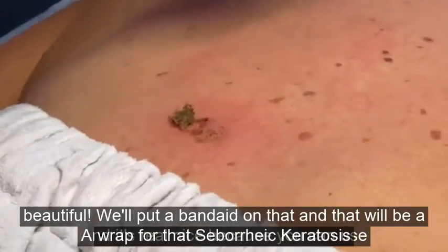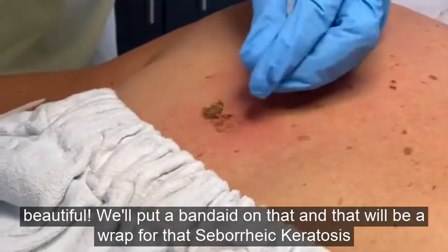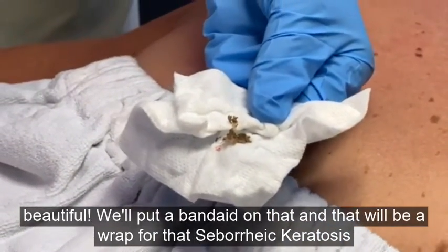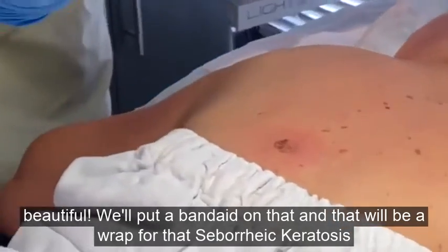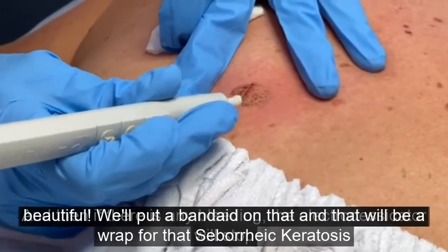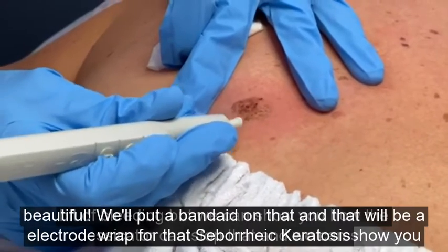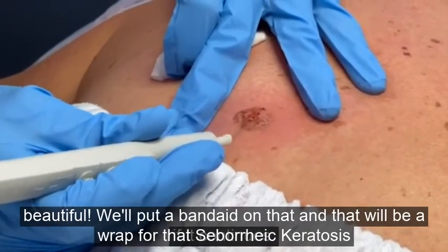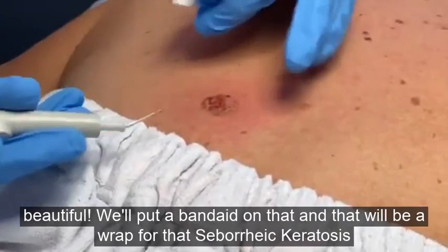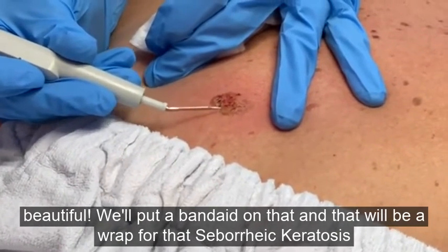It's really nice because you can use the electro desiccator to shave the top off, as Julene is doing, and it makes the skin nice and flat. If there is any bleeding, the electro desiccator will stop it — she hasn't really bled yet, but if it continues we can show how it coagulates. This is the same machine used in the operating room to coagulate blood vessels when they bleed. It's called a hyfrecator — it was the very first machine I got.